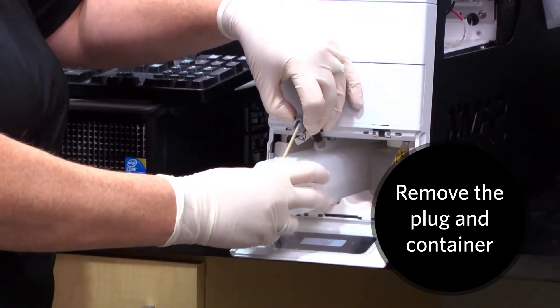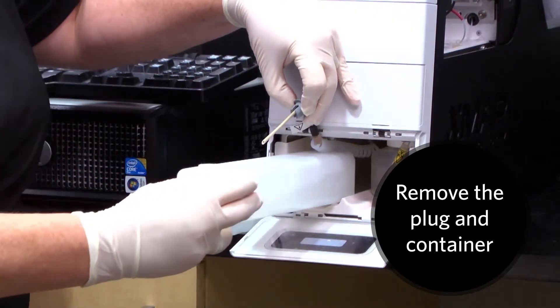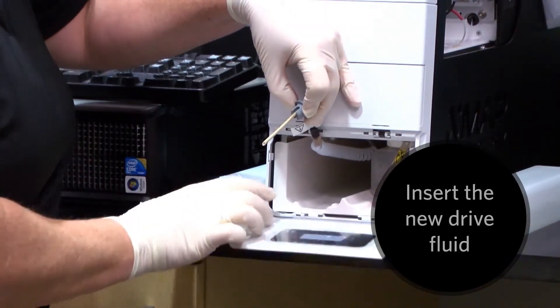Remove the tube and plug from the old dry fluid container on the left side of the fluid compartment and take out the container.